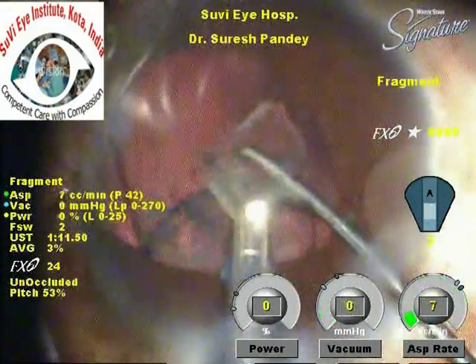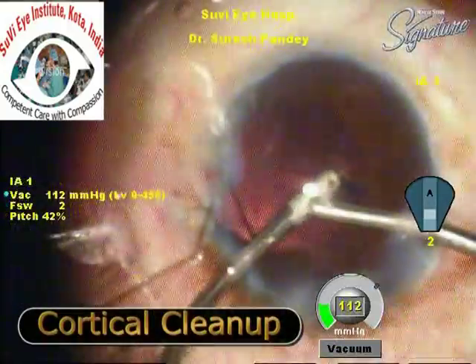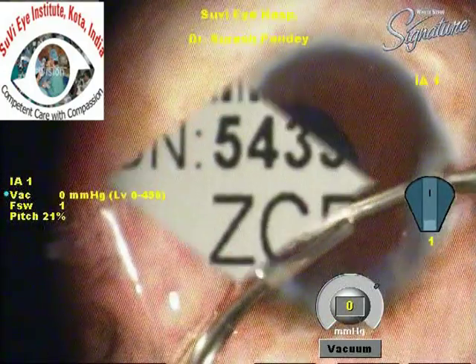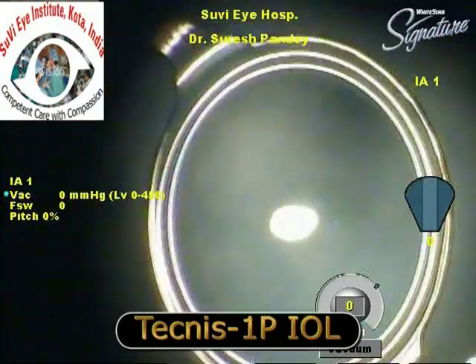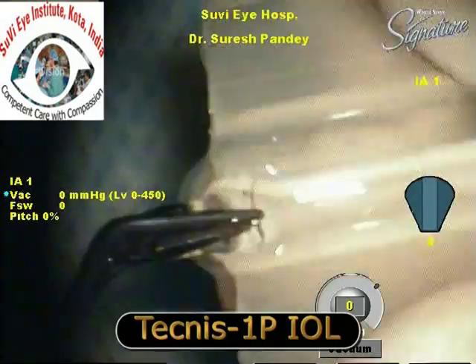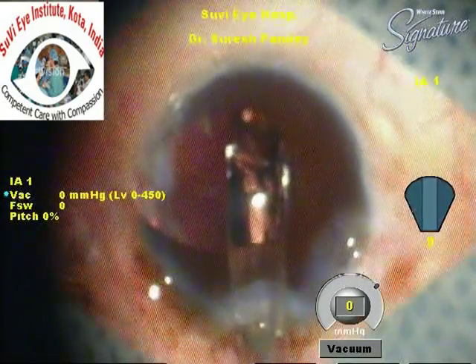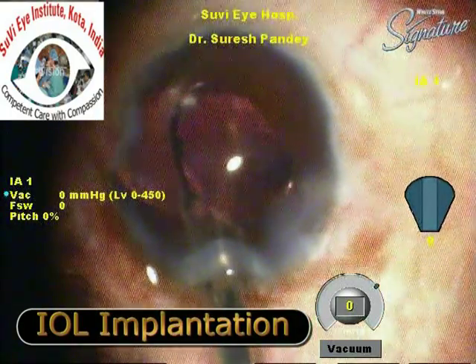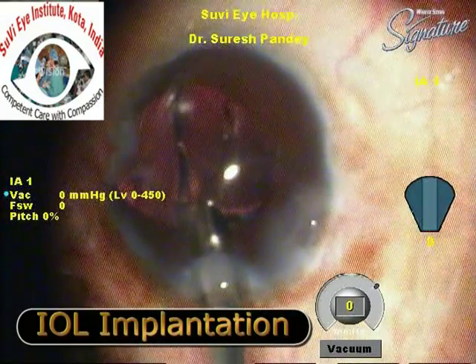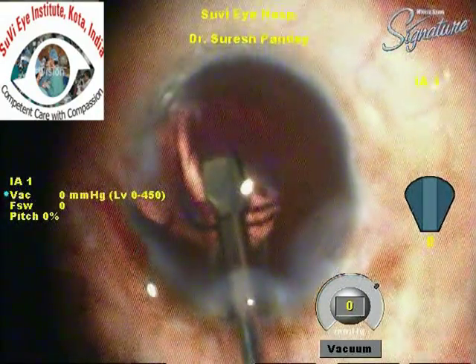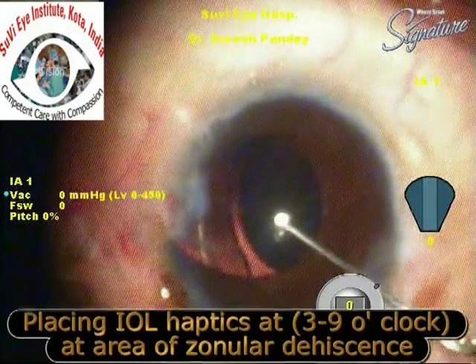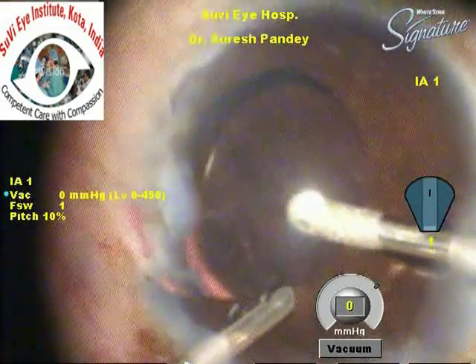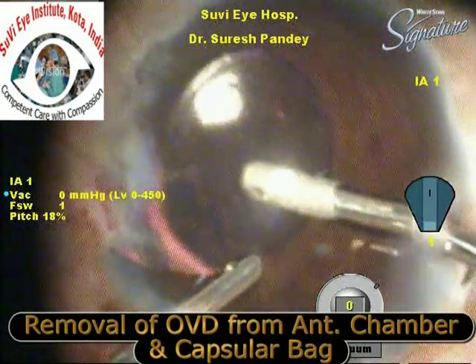A second instrument is used to guard the posterior capsule. We then perform cortical cleanup — good hydrodissection ensures we don't need to pull on the capsular fornices during this maneuver. Bi-manual irrigation-aspiration is safer in these cases. We are now implanting a Tecnis one-piece IOL; it should go smoothly into the capsular bag with no jerky movements. Most surgeons prefer to place the IOL haptics in the area of the dehiscence so the haptic also stabilizes the capsular bag.